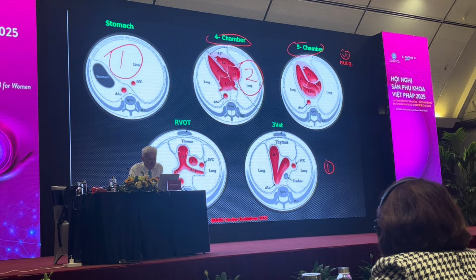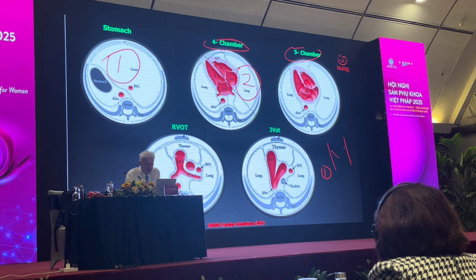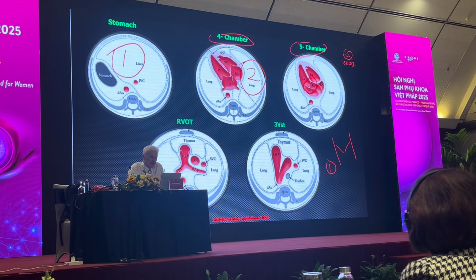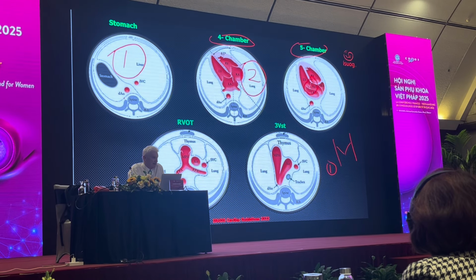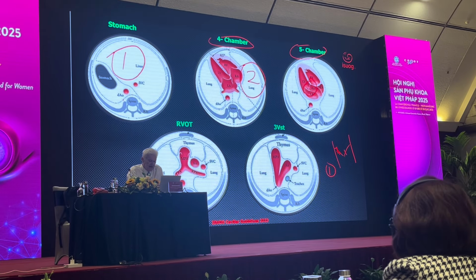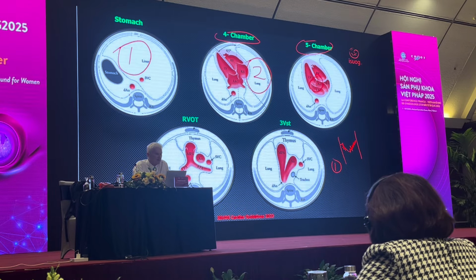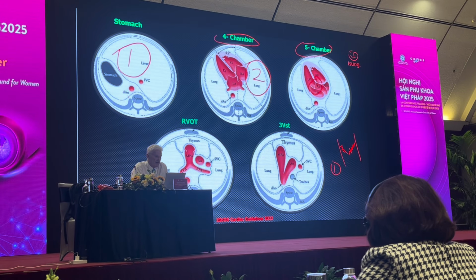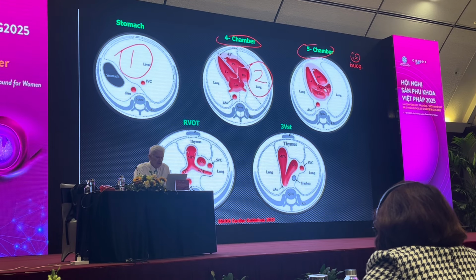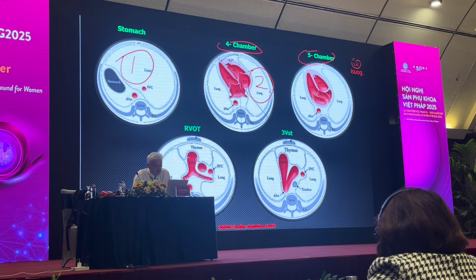The next thing I look at is the valve, and I expect to see the valve appear during diastole and disappear during ventricular systole. If it does not disappear and stays there, it's a feature of aortic stenosis. And I look to see whether the valve is thickened, and I will show you this in live scanning. So 1, continuity, 2, caliber, 3, the aortic valve.